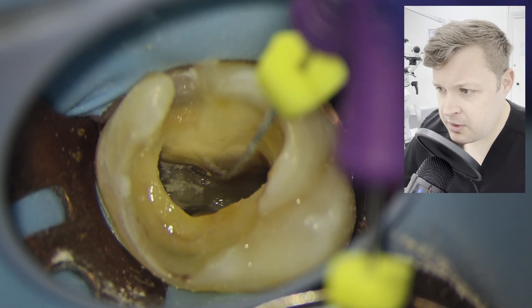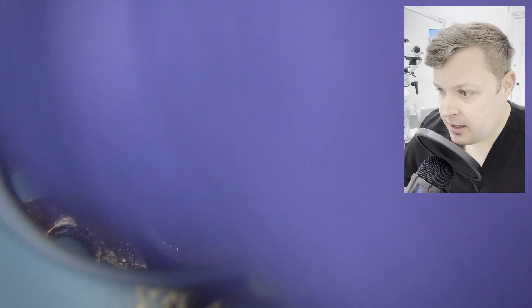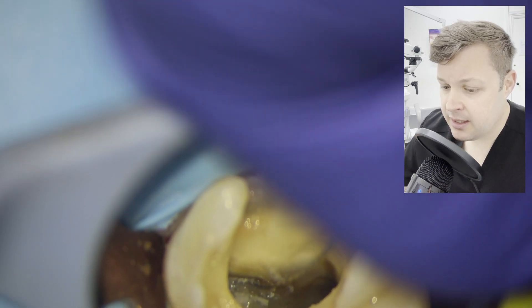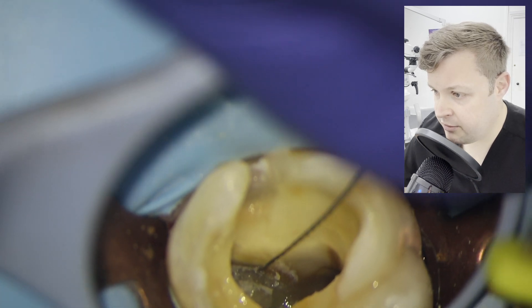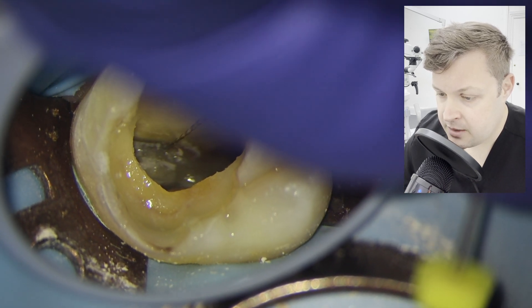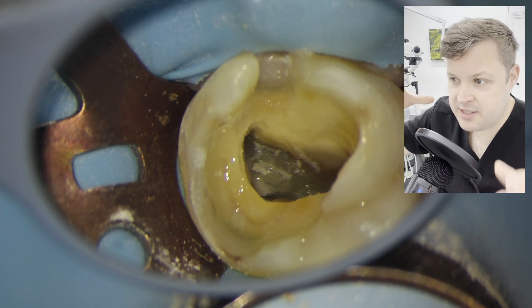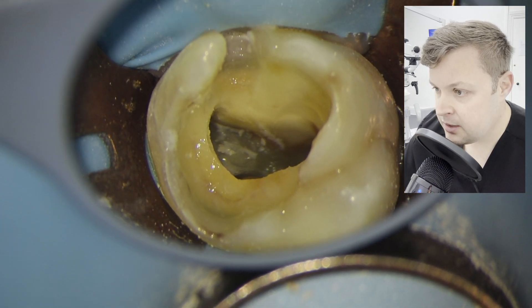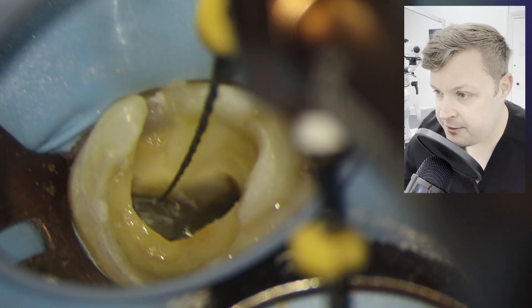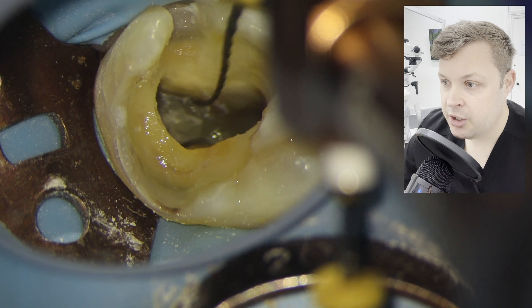I'm just having a very nice little twiddle with this K file. At the moment it's probably not advancing because there's still a significant amount of dentin covering this orifice. As we all know, it's usually the dentin further up that stops the file from advancing, not the advancement of the hole itself. So now I'm going to use a fantastic file I love by HyFlex — it's a 1503 rotary file — and I'm just very gently opening up this orifice.